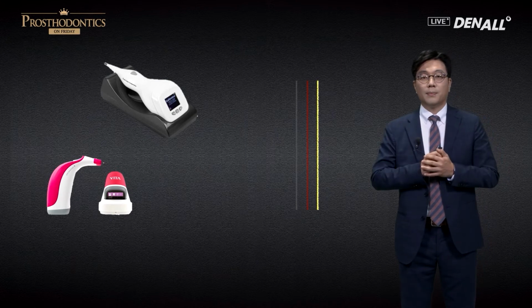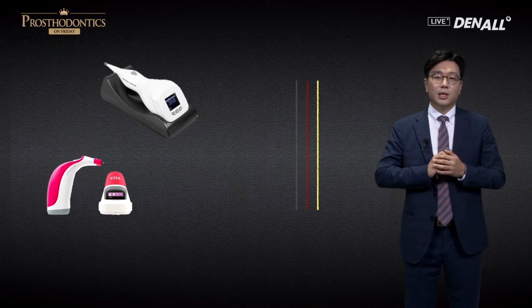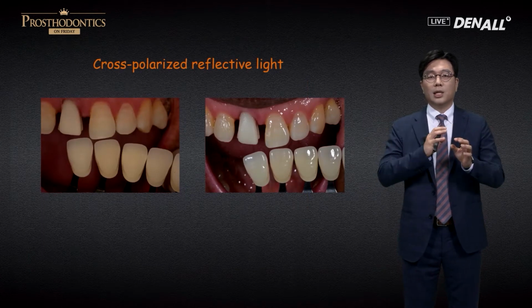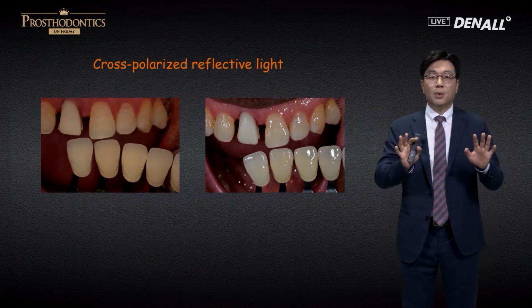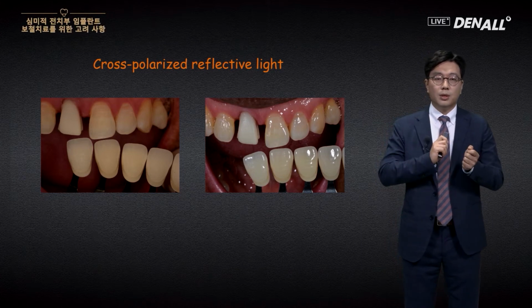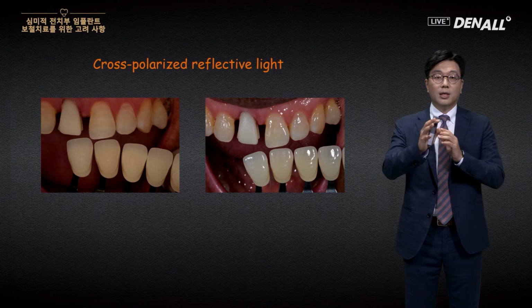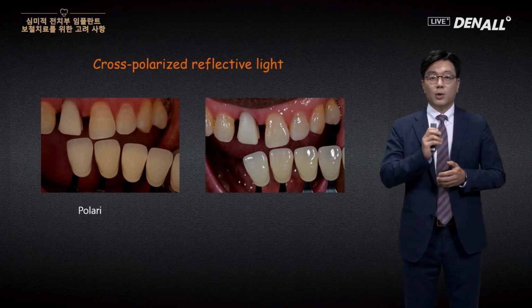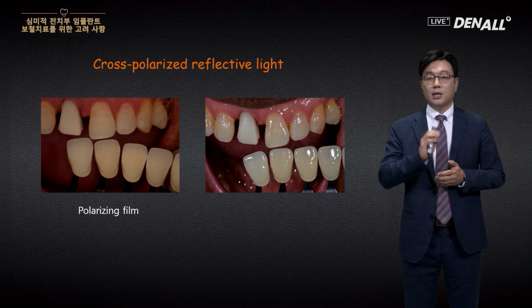in the teeth, there are many different colors. Reflective lights can be interfering, and we need to eliminate the interference in selecting a shade. For anterior aesthetic prosthesis, a digital camera can be used to take the pictures. On the left and right, the colors look different.